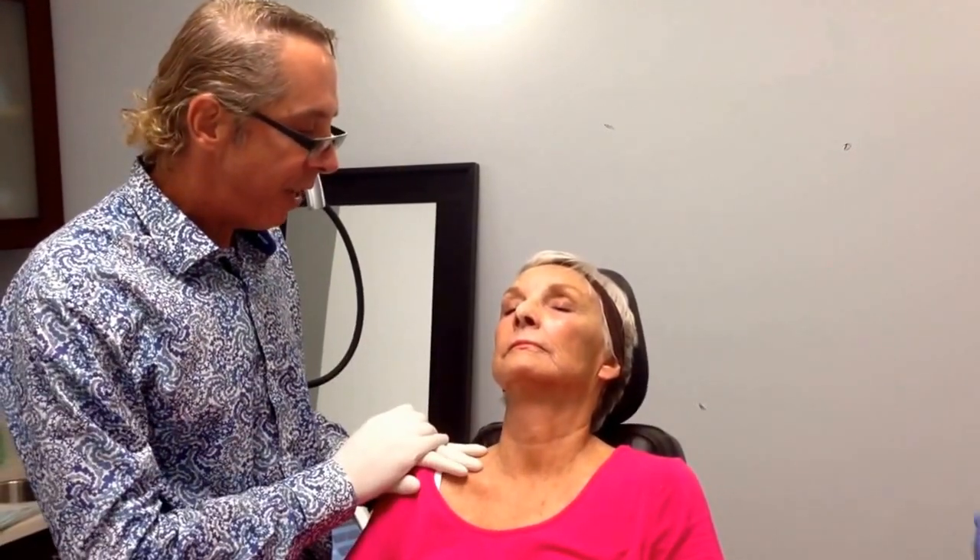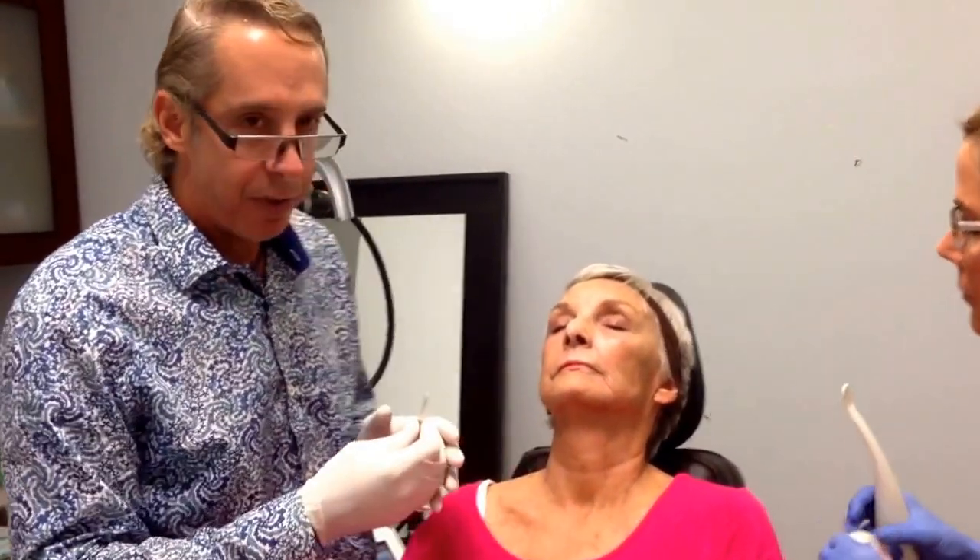Hi, I'm Dr. Steve Leiner, and what I'm demonstrating today is the nerve block that I do for my facelift. This patient has allowed us to film her. She's had a topical anesthetic with 23% lidocaine, 7% tetracaine for about an hour.